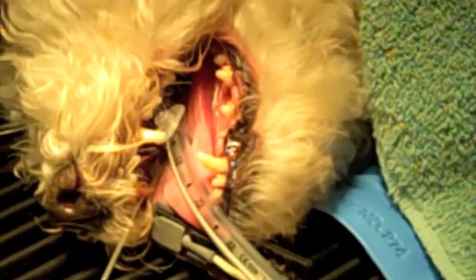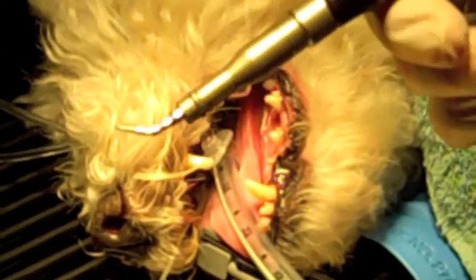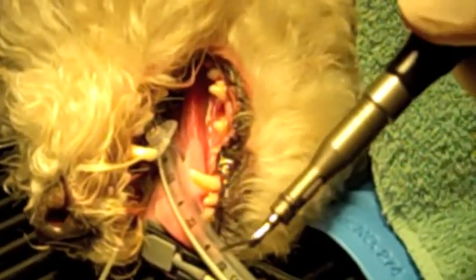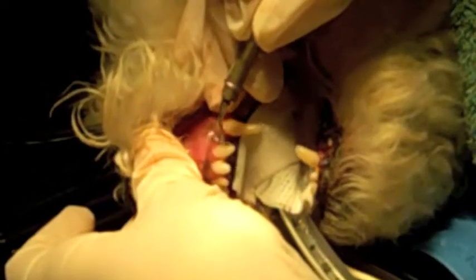Now we'll begin the ultrasonic scaling of the teeth, which uses this instrument, and it will shoot out water to help just flush away some of the debris as you get it off the teeth.